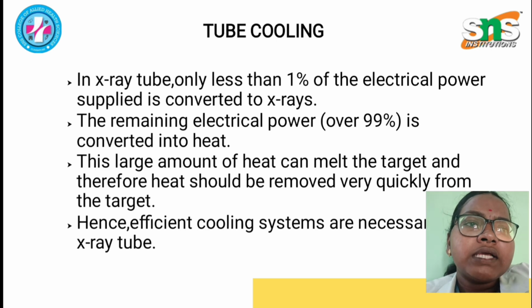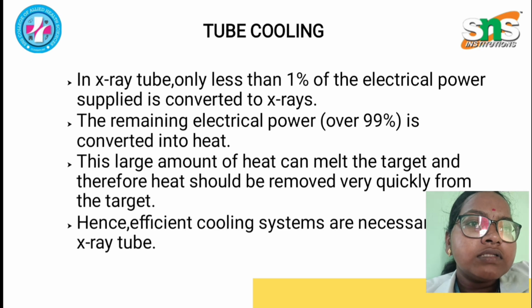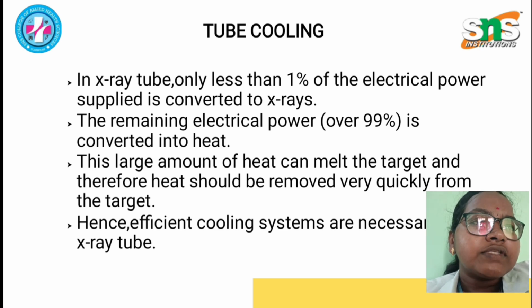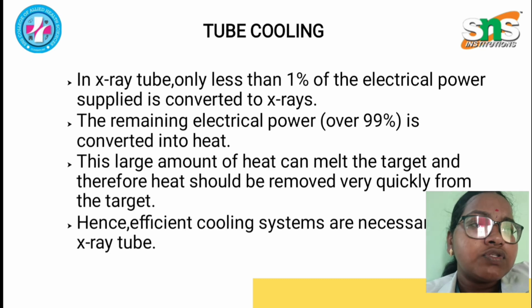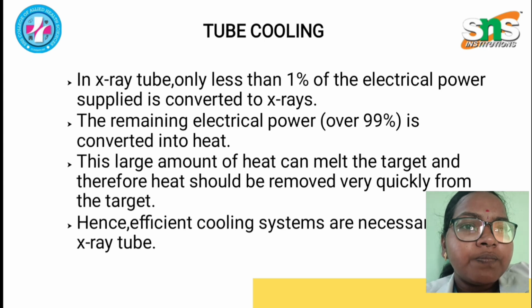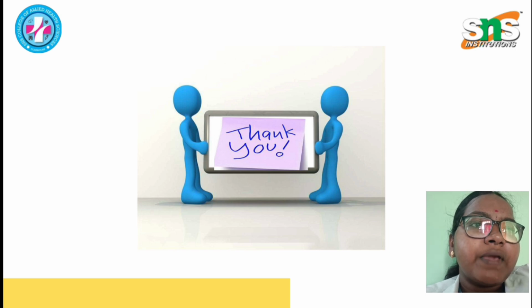Tube cooling is mandatory in the X-ray tube, because only 1% of the energy is produced as X-rays, and a maximum of 98 to 99% is produced as heat. In order to avoid this heat, which will damage the X-ray tube, tube cooling is necessary. So an efficient cooling system should be maintained.